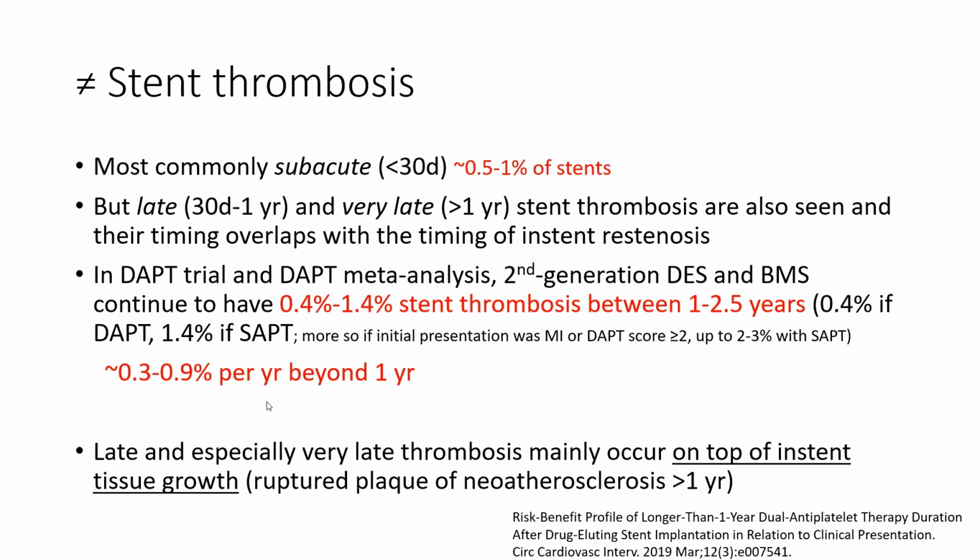Now, I cannot talk about stent restenosis to fellows without trying to distinguish it from the other big process, stent thrombosis. Generally speaking, stent thrombosis and stent restenosis have different presentations and different timings. However, there is a lot of overlap, as I will show. And that's why you should always, in an MI presentation with a stent obstruction, think stent thrombosis or stent restenosis or both. Stent thrombosis is most commonly subacute, less than 30 days.